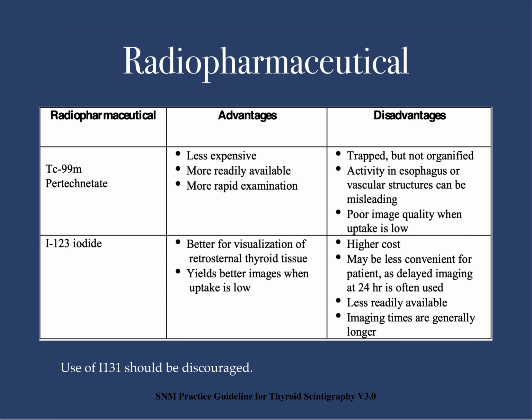In certain circumstances, we can use technetium-99m pertechnetate. Most often, this is used when patients just got iodinated contrast, and the thought is we should use that to avoid competing with the iodine. It tends to be case-by-case selective. I'm honestly not sure that we really should use it. I think I-123 would give us an answer in almost every situation.